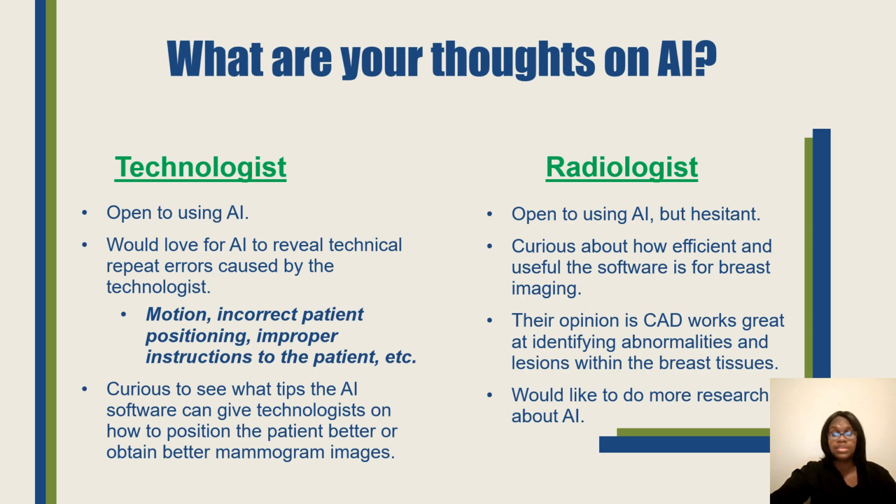So I would like to know your thoughts on AI. I did talk to a lot of technologists, mammo technologists, and they are open to using AI. They would love to see how it can help them with motion, positioning the patient correctly. They're curious about how AI works. With the radiologists, they're open to using AI, but they are a little hesitant. They would like to do more research about it. And their opinion right now is CAD works great at identifying abnormalities and lesions within the breast.